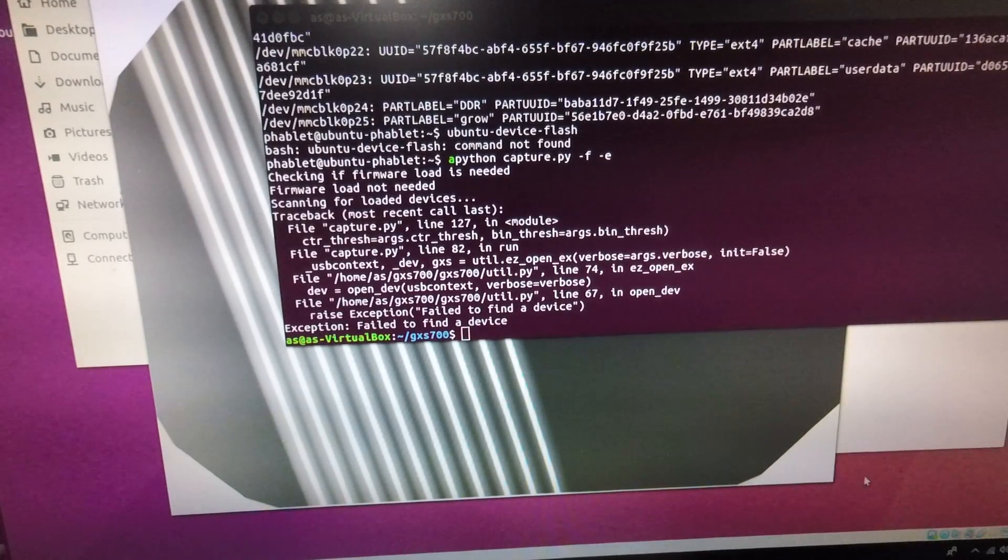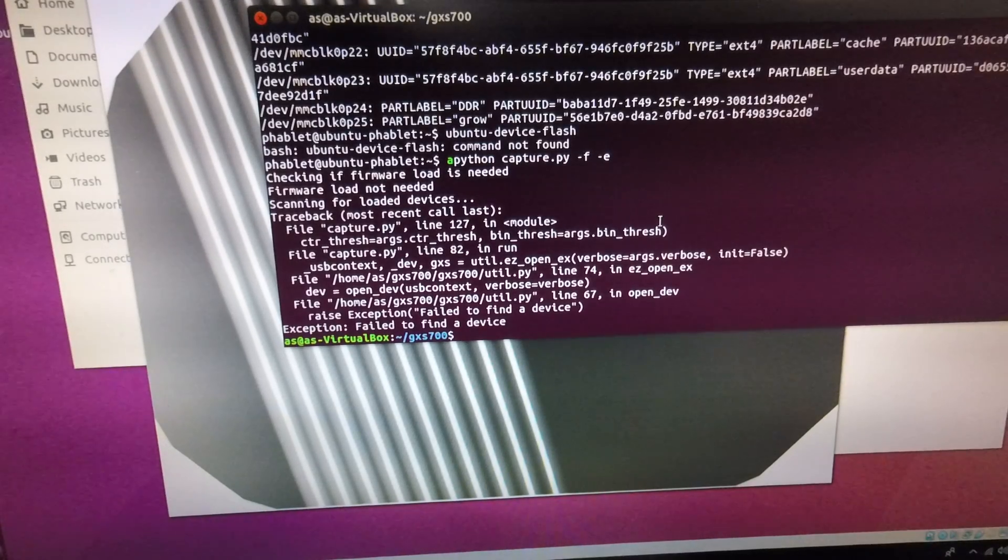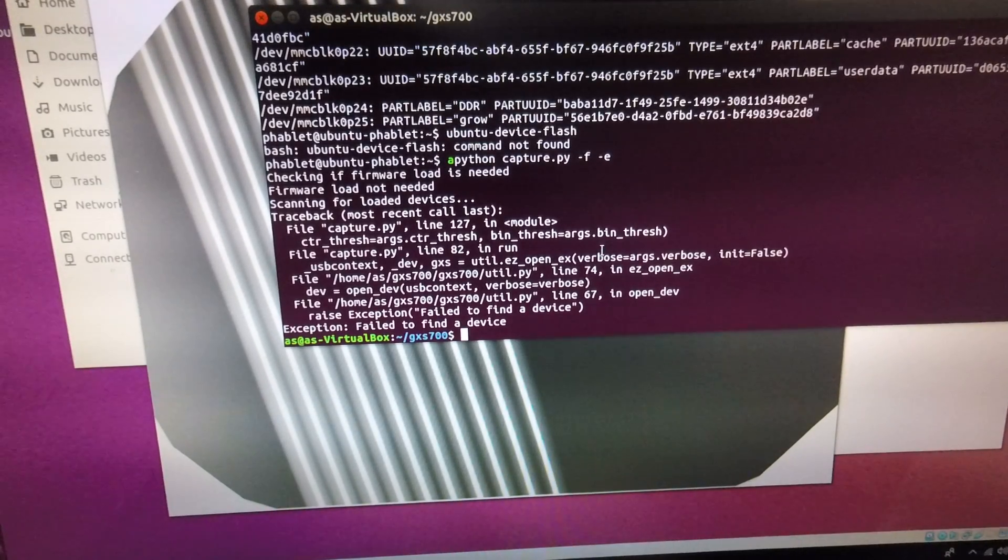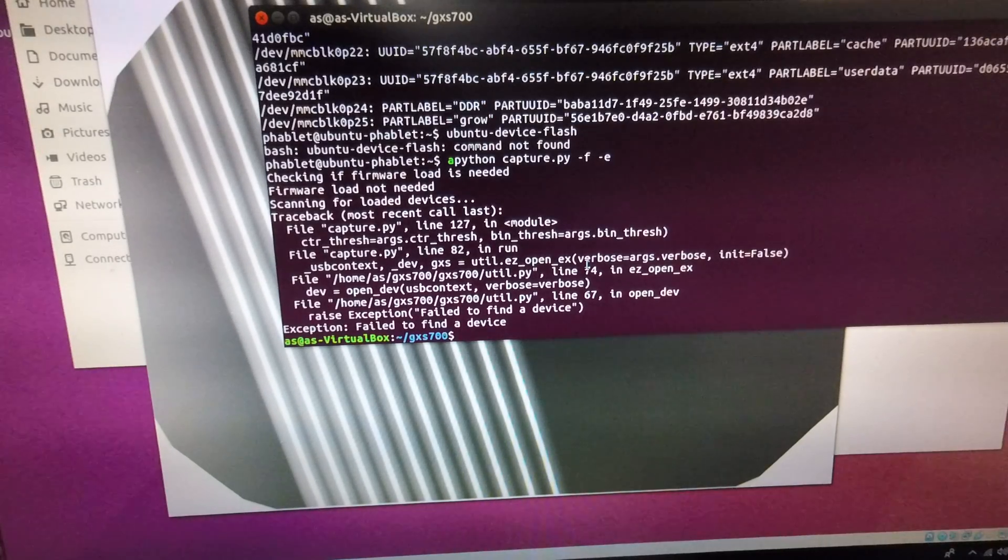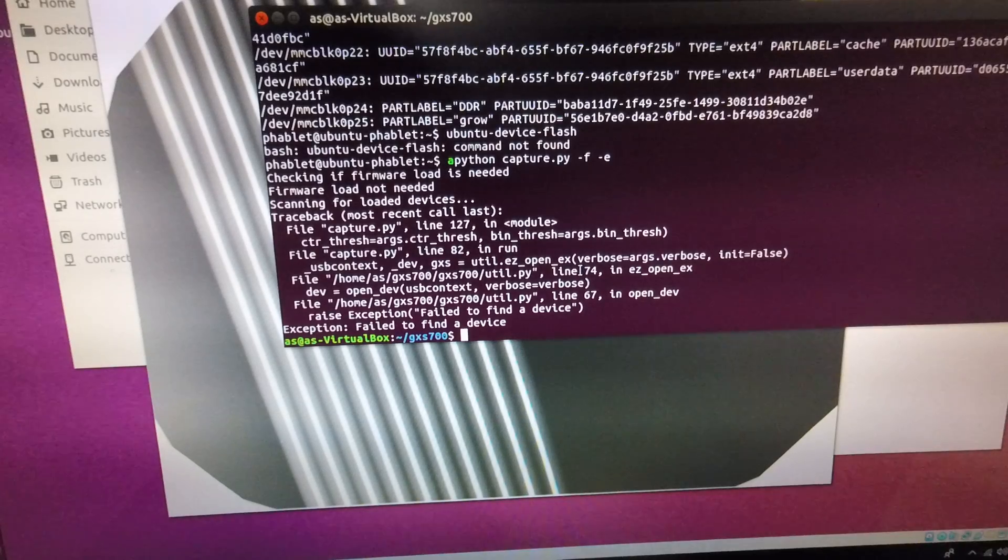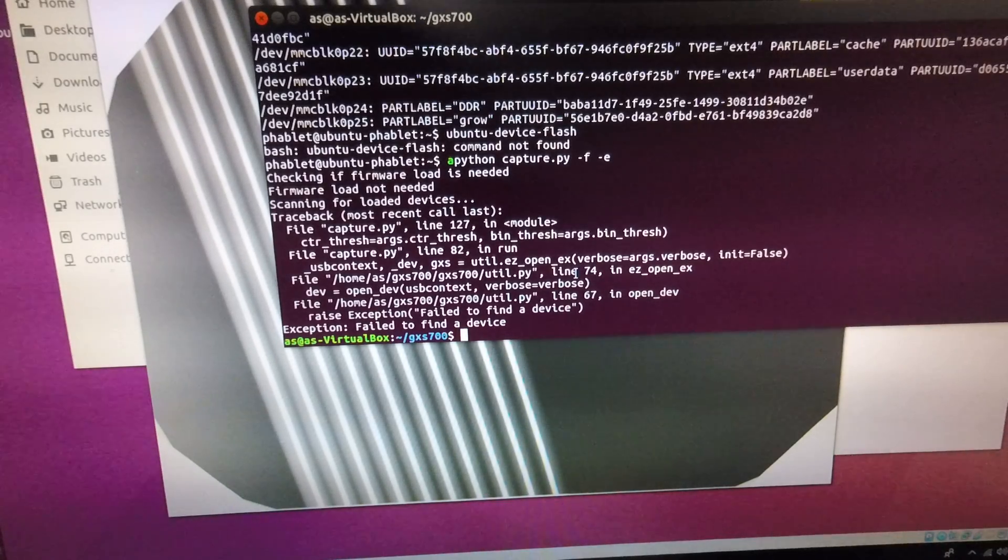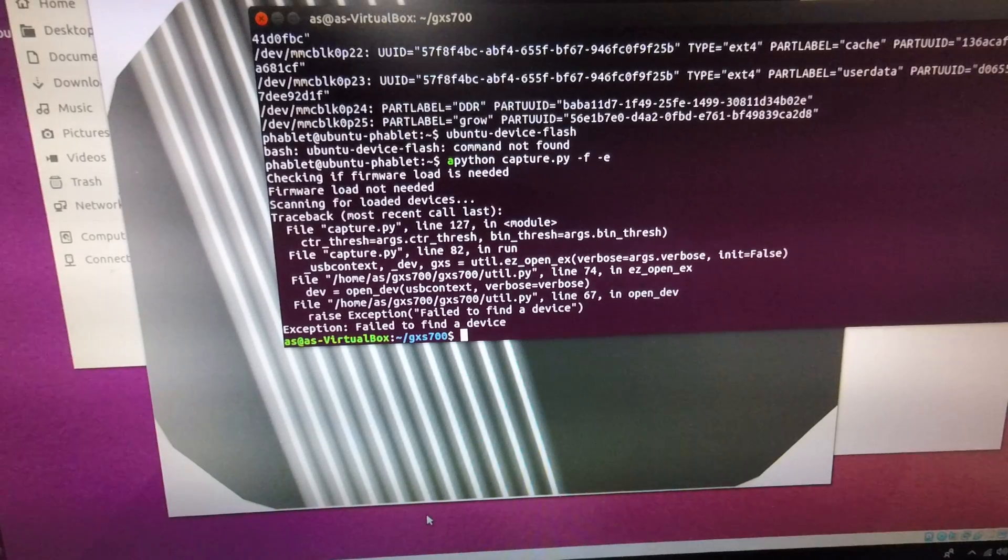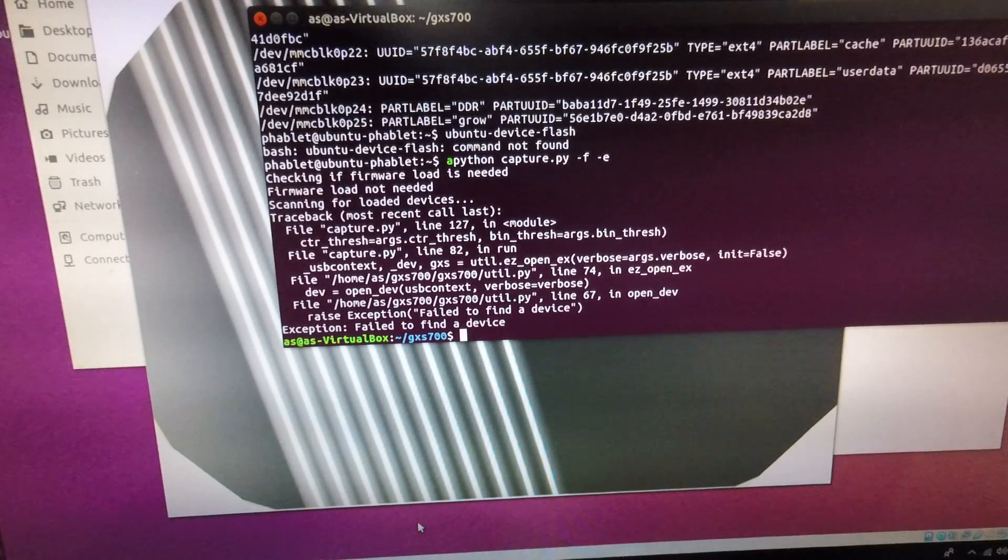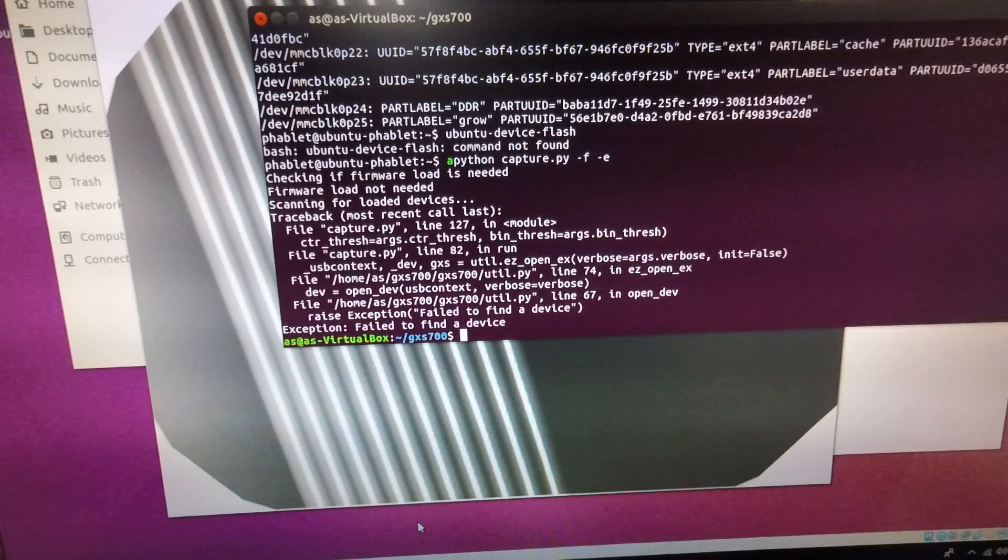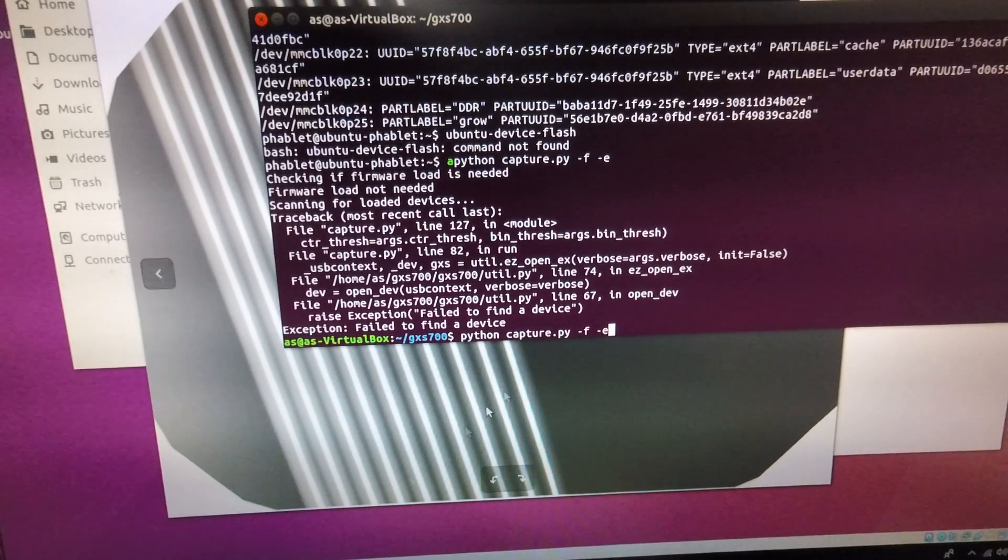It'll then be connected onto the virtual machine and on this virtual machine I've downloaded the Python code UVscada written by John McMaster. This is available for free on GitHub. It's basically a Python code to interface the Gendex sensors with Ubuntu. So I'm ready in the directory.